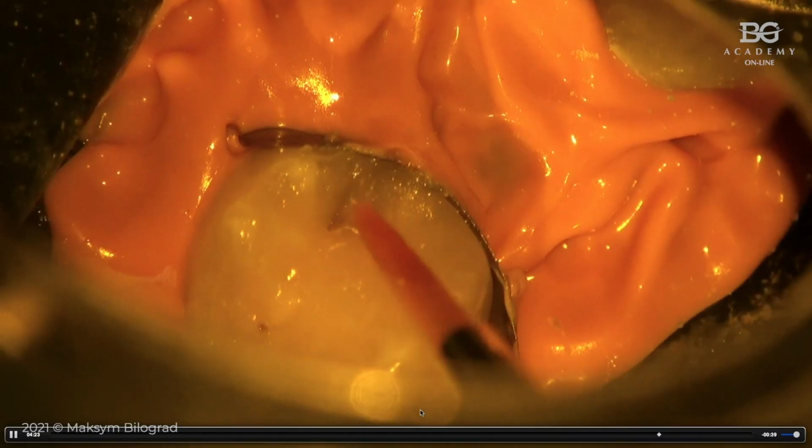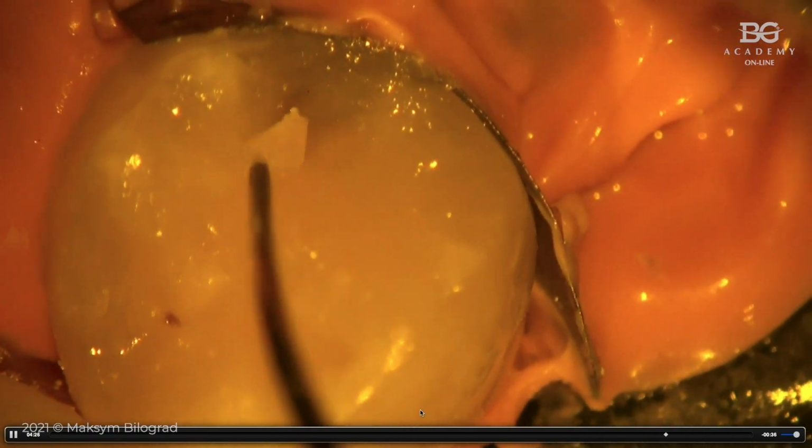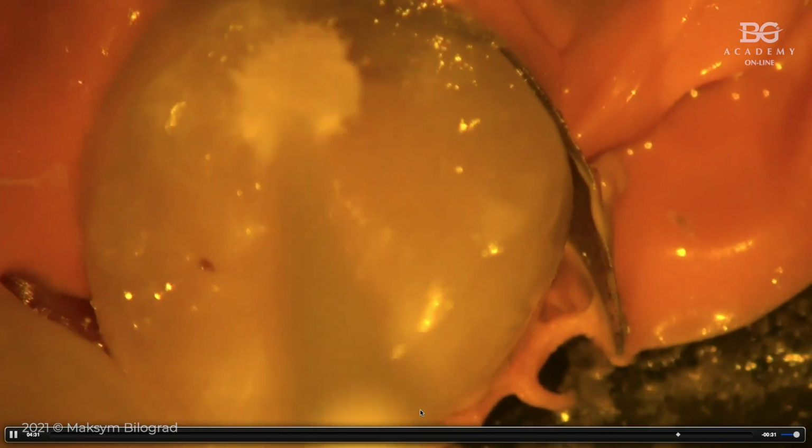Now I can say, since I have experience with these conservative treatments and composite restorations as well, that composite has to be easy, has to be repeatable, and has to be also non-time consuming. And we have a protocol now. We have very simple protocols to work with direct composite materials. If I would have the same case now, I can rebuild dentine in just a few layers, and the final layer of enamel will be done with this layering and making fissures with small increments.